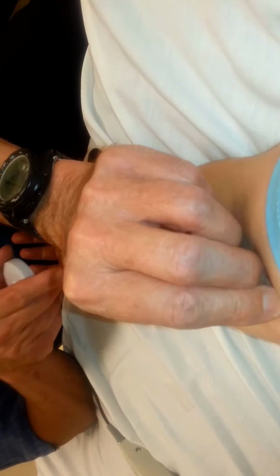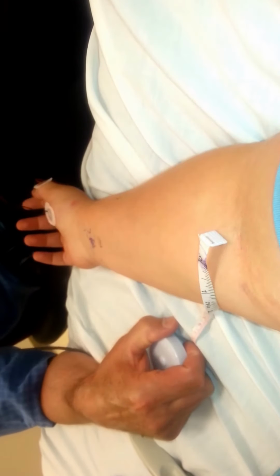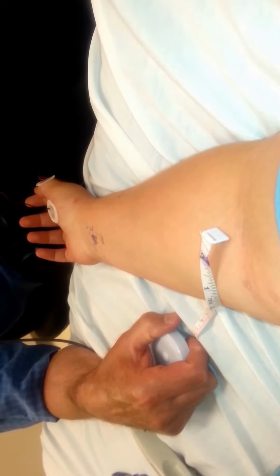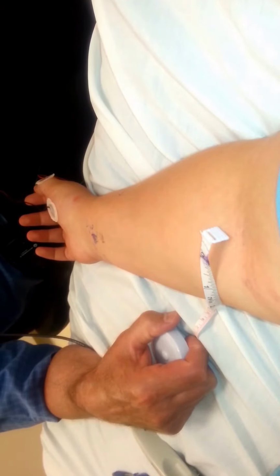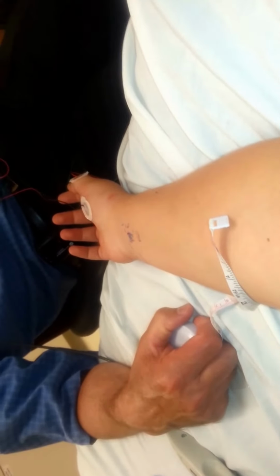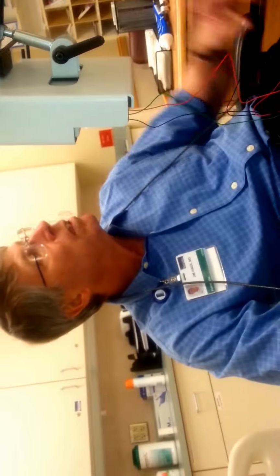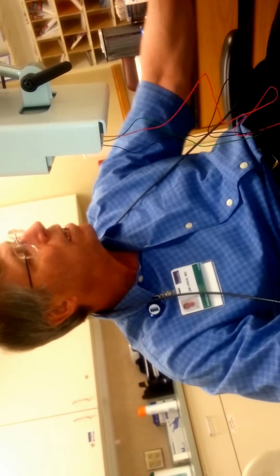Now we're going to catch you here. Okay, same nerve. There we go. So that's how fast it travels down to your thumb from here. So if we know the difference in distance between these 2 points, which is 209 millimeters, and we divide it by the difference in time between here and here, we can come up with a speed in meters per second. And yours is 60 meters per second. 50 meters is like half a football field, and yours is 60. So that's very fast. Anything over 50 is good.